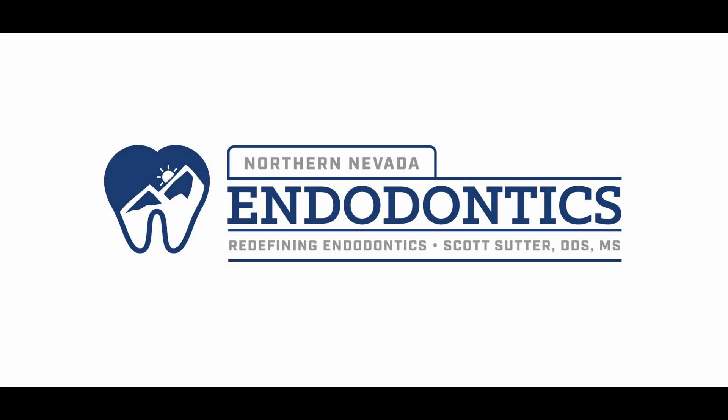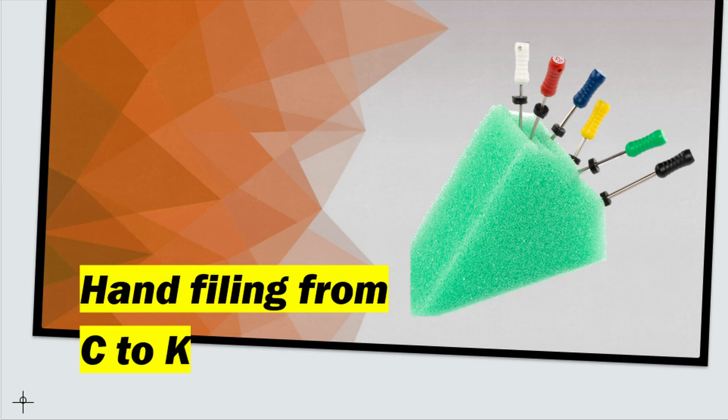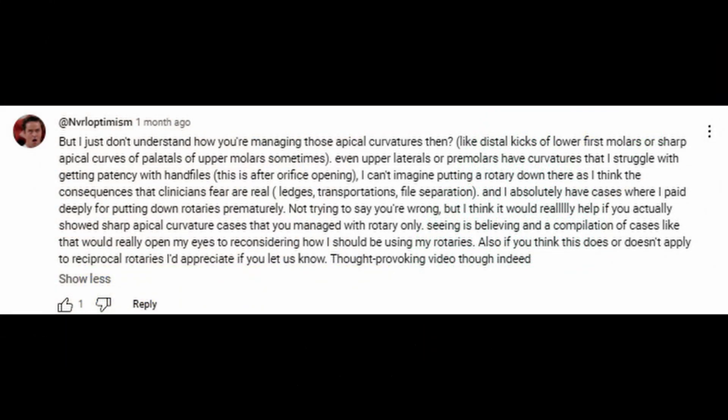Hello everyone, and welcome back. Today we have a follow-up to my recent video on hand filing. We had a great comment from Overall Optimism asking what do we do in cases where there's a sharp curve. And I said, as soon as I get one, I'll show it to you.